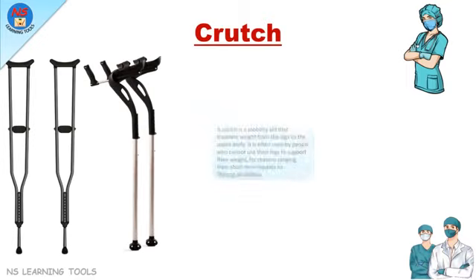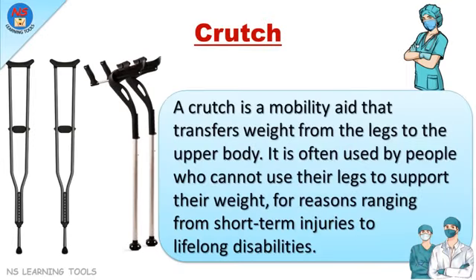Crutch. A crutch is a mobility aid that transfers weight from the legs to the upper body. It is often used by people who cannot use their legs to support their weight for reasons ranging from short-term injuries to lifelong disabilities.